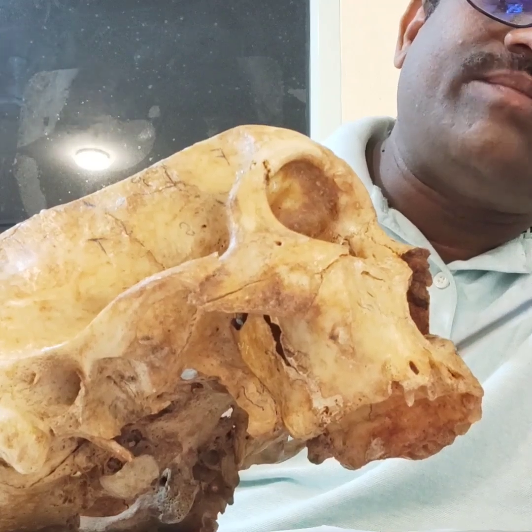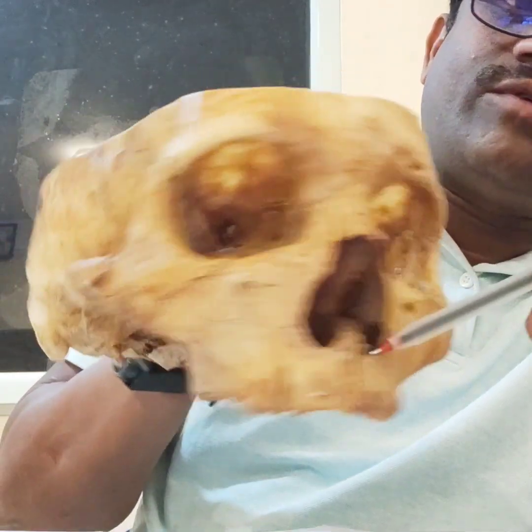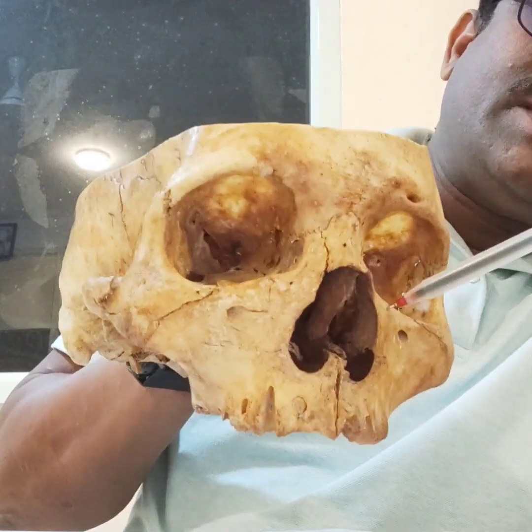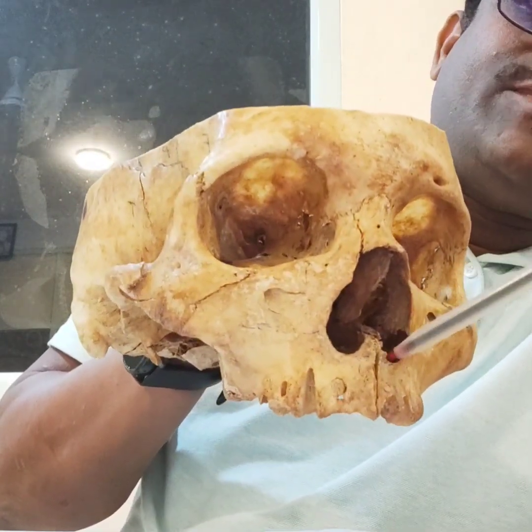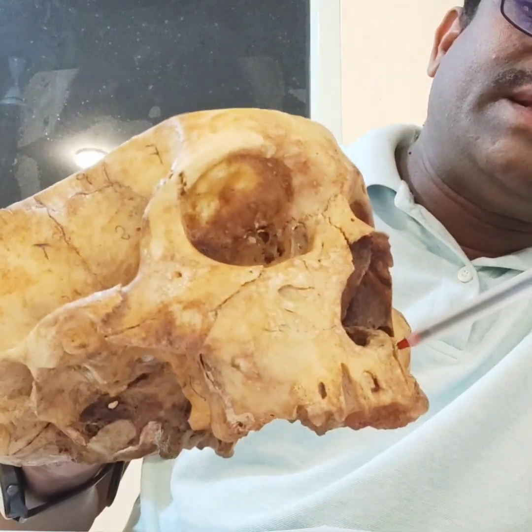That is the nasal spine. This is the nasal spine area. You have to perforate the nasal floor here. Can you see? Usually the implants in the X-ray will be visible here. This is perforating the nasal floor.